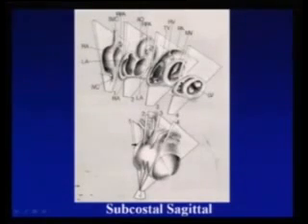This Eustachian valve is very important, which we have to see in the sagittal plane at the most right stage. Then the SVC joining the right atria, and here you will see the right pulmonary artery in short axis and the LA. Another thing you see is the foramen ovale. If it is patent, the flap of the foramen ovale is always towards the left atria, so it defines the left sided atria. Then as you sweep towards the left, you will find the aorta coming from the left ventricle. Then you define the right ventricular outflow tract, and then the ventricles in short axis. In all these views the ventricular septum comes in plane, and you look for a VSD if it is there.